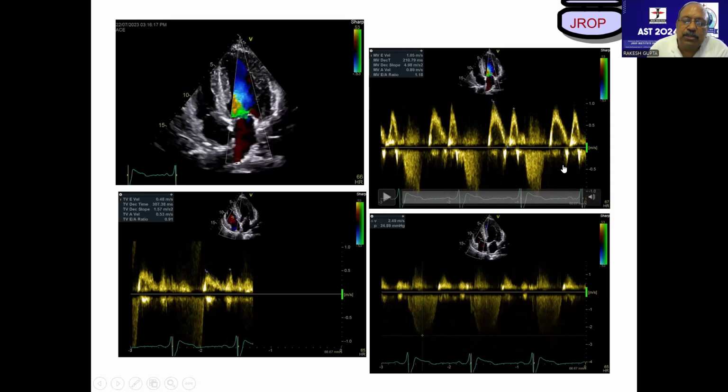Whoever has a machine, go tomorrow, go to physio. In physio, two buttons will open up. One is ECG, second is respiratory. You switch on your respirogram, and whatever is end expiratory, whether it's smaller or taller, you will take this as an evaluation parameter. So the patient has a diastolic function, which is smaller, respiratory movements are seen. And we have taken this because we felt this is end expiratory.